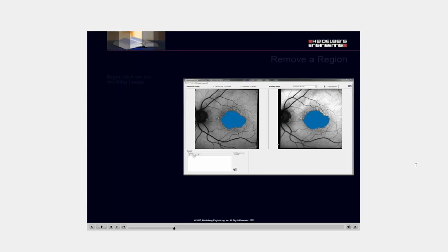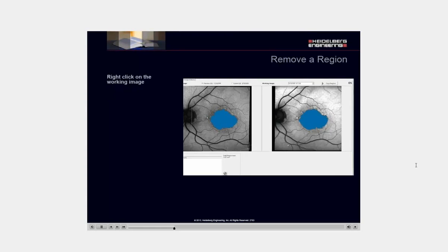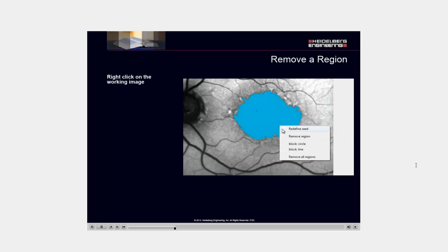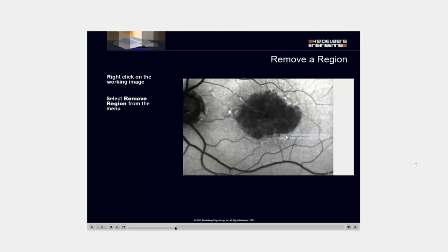Right-click on the working image. Select Remove Region from the menu. Select Remove All Regions.